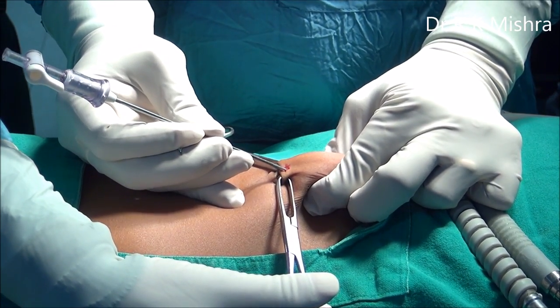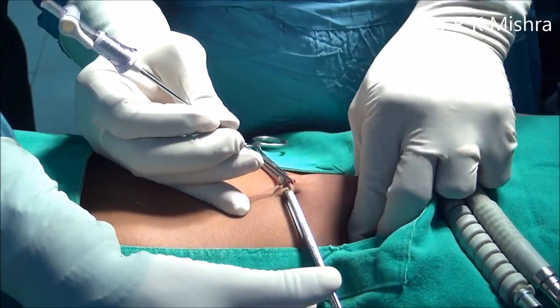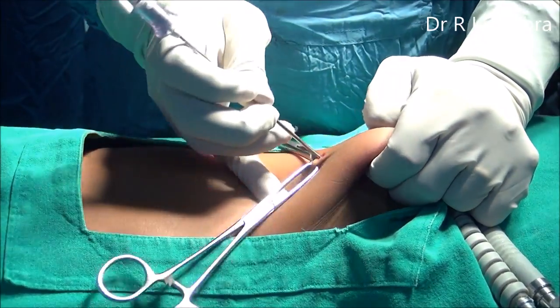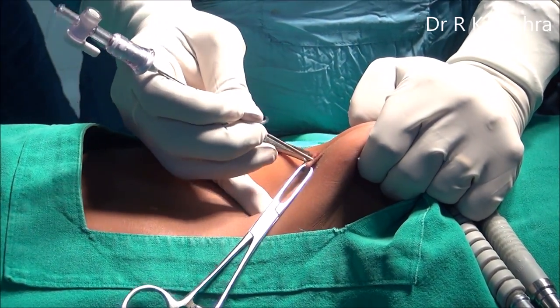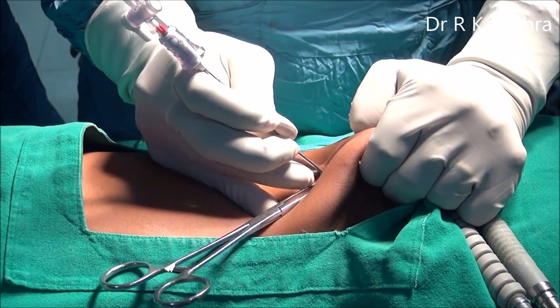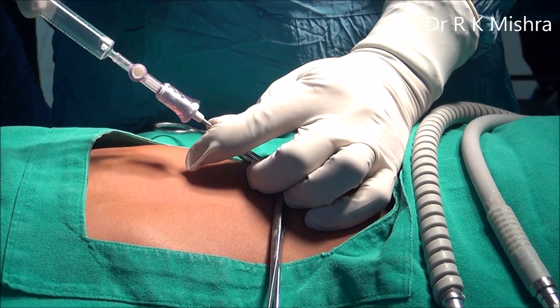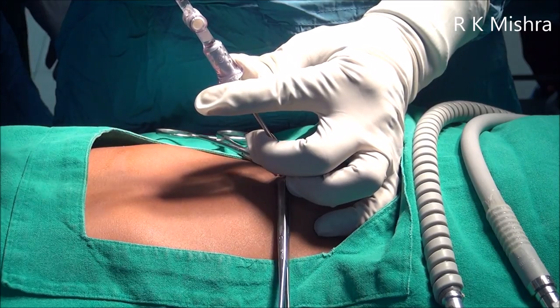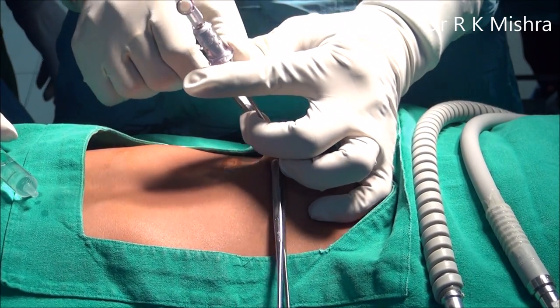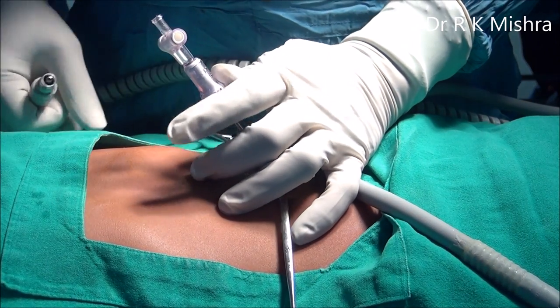You should lift the abdominal wall, not near them, otherwise it will make a skin fold and the Veress needle will go into the muscles. Hold it halfway between the anterior and posterior surfaces, pressing with the left little finger so that direction is towards the anus but perpendicular to the abdominal wall. Within two clicks you will be inside. This is the irrigation test, this is the suction test, and here is the hanging drop test, which is sucked in.